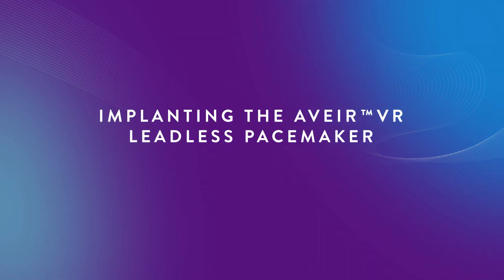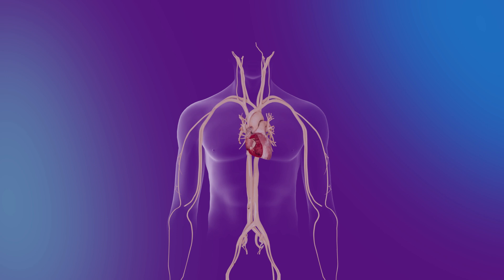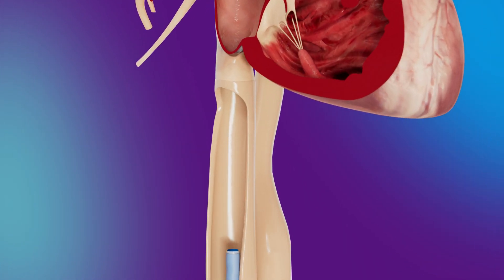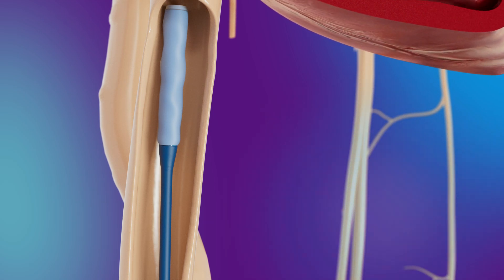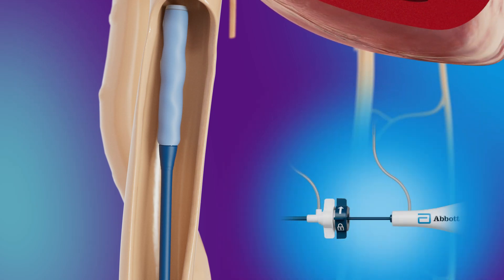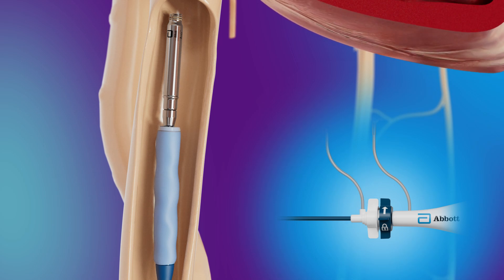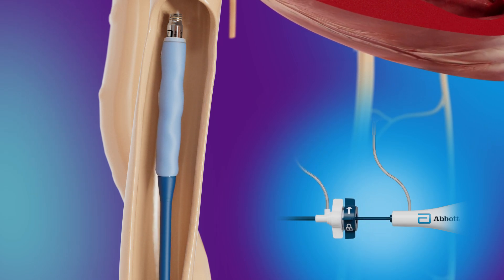Implanting the Avere VR Leadless Pacemaker: the Avere VR LP implant procedure begins by using the Avere introducer to gain femoral vein access. The delivery catheter and device are then inserted and advanced to the IVC. A pliable, braided protective sleeve fully covers the LP during catheter navigation to reduce risk of damaging the helix or injury to cardiovascular structures.